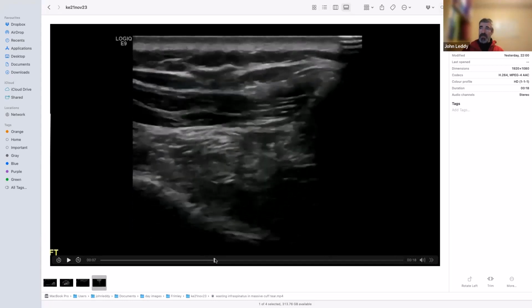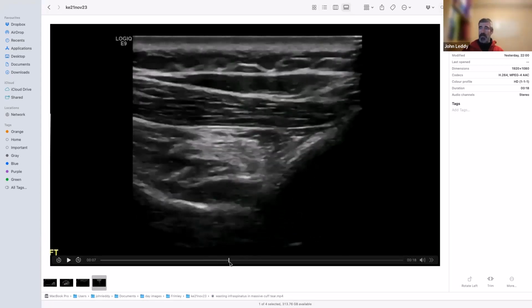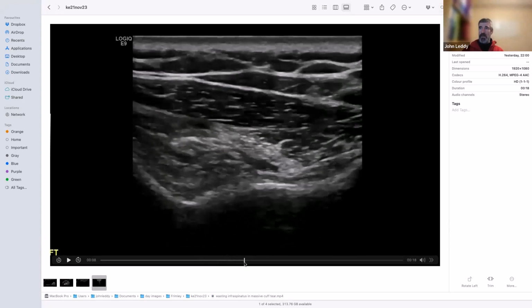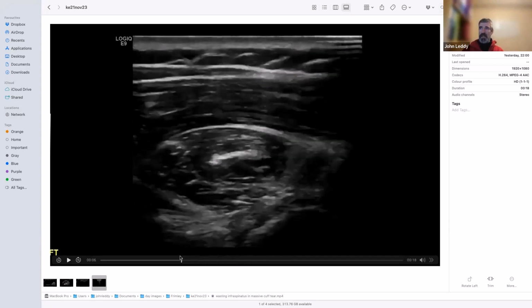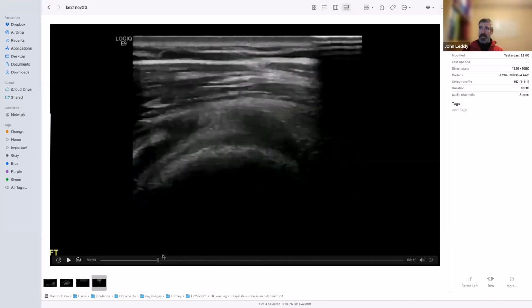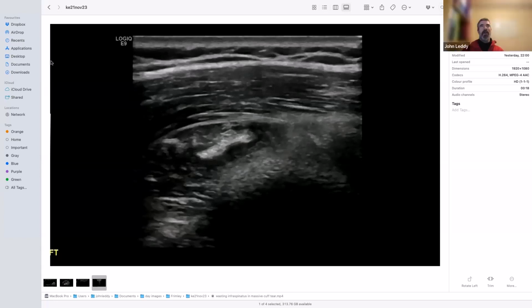And then you see that bright area. This should be normal infraspinatus muscle, but it's very, very bright. This is actually because it's torn distally. The tendon is actually torn off. But if I come back, you'll see the contrast between that and the teres minor. So that's teres minor with its lovely, healthy texture. And this is infraspinatus here, which just looks like a mess.